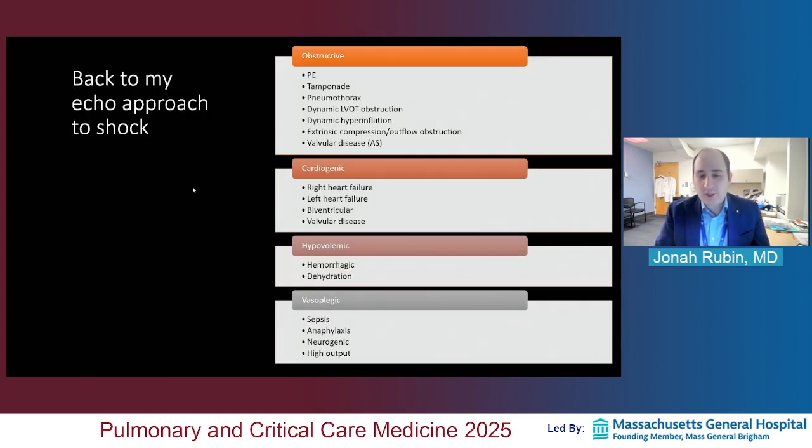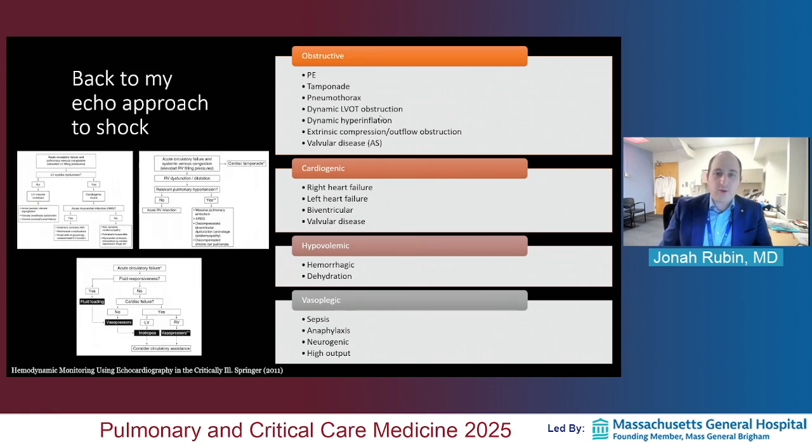So how do you actually pick up the probe and go through a case and help determine or differentiate the shock that you have? So as I mentioned, I don't use these buckets necessarily to guide my approach. And if you look for algorithms for how to think about shock through the lens of an ultrasound, you'll find them. But these algorithms are more intended, in my mind, for the cerebral process, the thought process your brain should go through when you're distinguishing between different types of shock.